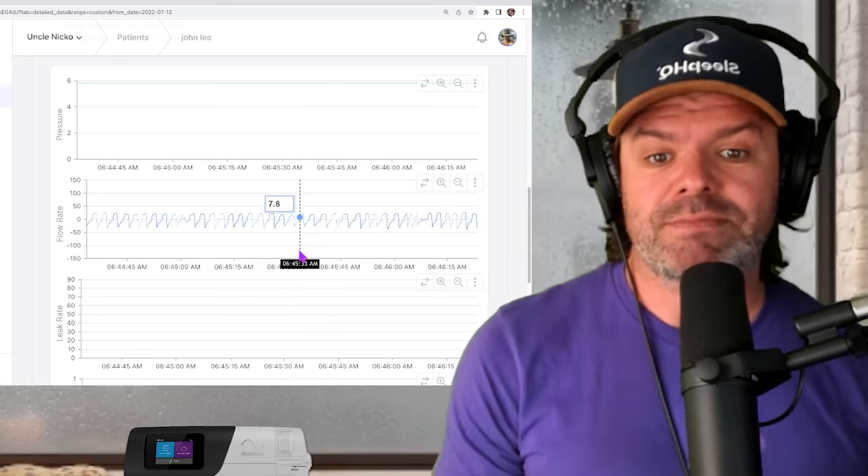But check out the flow limitation — it's almost all gone. And now his blood oxygen levels: the original data on the left shows all those desaturations, and the new data at 10 centimeters pressure is so much more stable. That's what we want to see. This will make a massive difference to John's overall sleep quality and therapy. Check out his pulse rate too: previously 74, and with the new settings at 10 centimeters it's dropped to 71, because there's more oxygen in his blood so his heart doesn't have to work as hard.